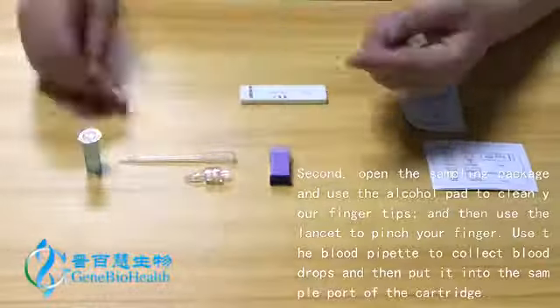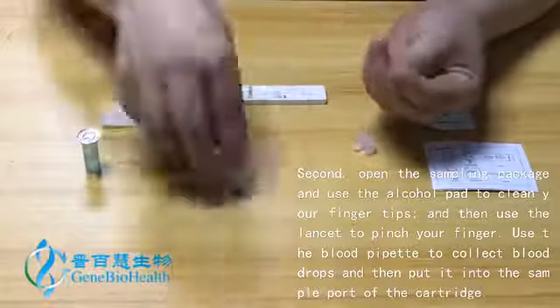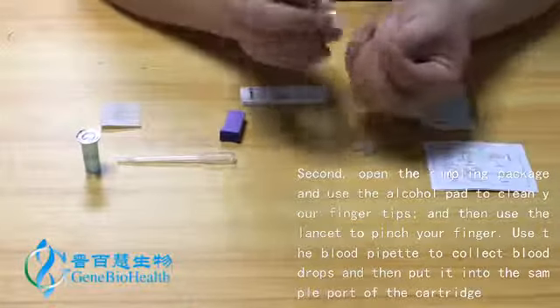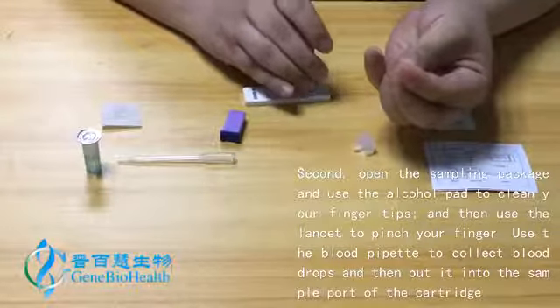Second, open the sampling package and use the alcohol pad to clean your fingertips, and then use the lancet to pinch your finger. Use the blood pipette to collect blood drops, and then put it into the sample port of the cartridge.